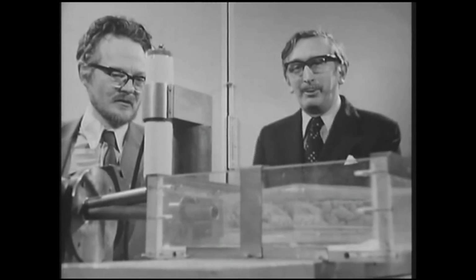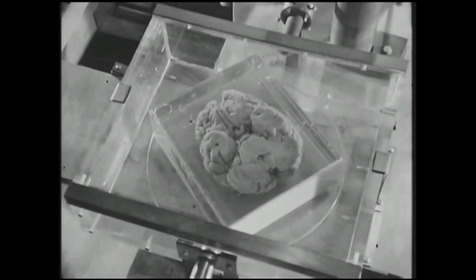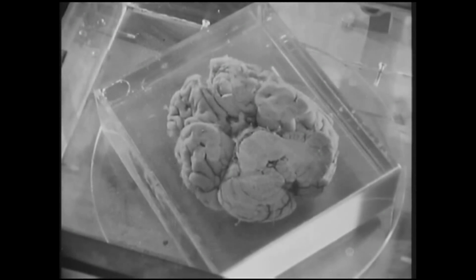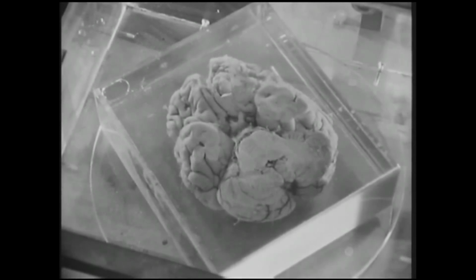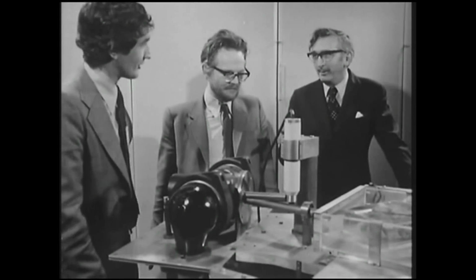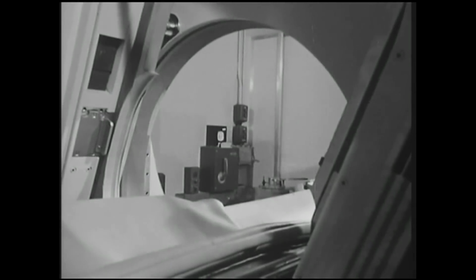I had to go around to abattoirs and cut out brains from cows, but unfortunately these were damaged by their method of killing, so that we found ourselves travelling across London to the Jewish kosher houses in which they killed by bleeding the bullocks. And it was quite a job carrying these across London in a paper bag to put on the machine. The ventricles did show up very well, and it was just a matter then of making a clinical machine.